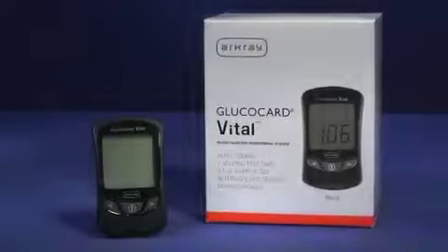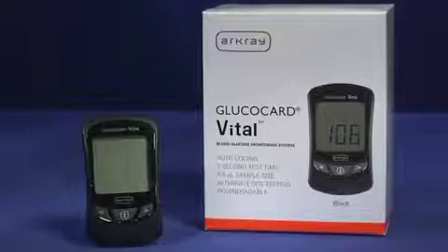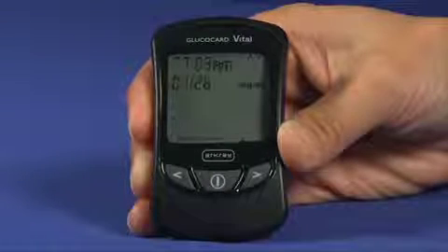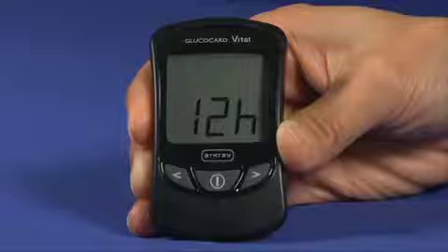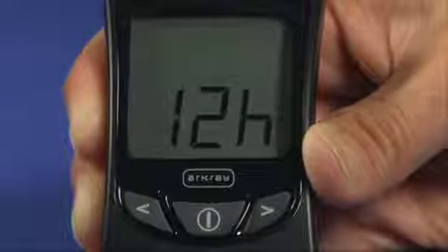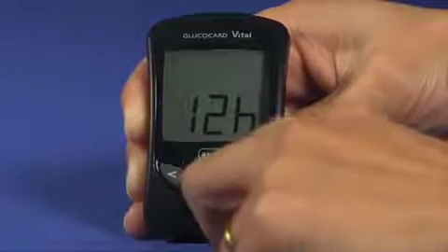Before using the Glucocard Vital System for the first time, you should set the time and date to ensure that results are appropriately marked in memory. To enter the setup mode, press the on-off button to turn the meter on. When the insert test strip symbol appears, press and hold down the on-off button for longer than 2 seconds to enter the setup mode. The time format will appear on the screen. Select either the 12- or 24-hour format by pressing the back or forward button, then press the on-off button to make your selection.